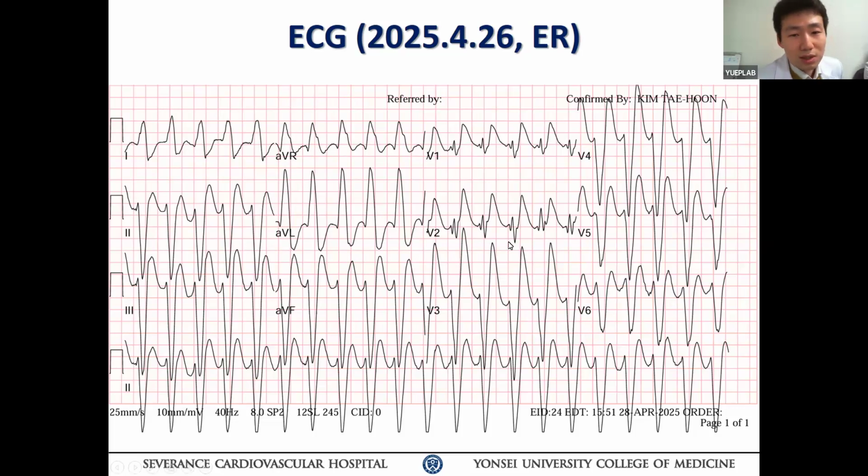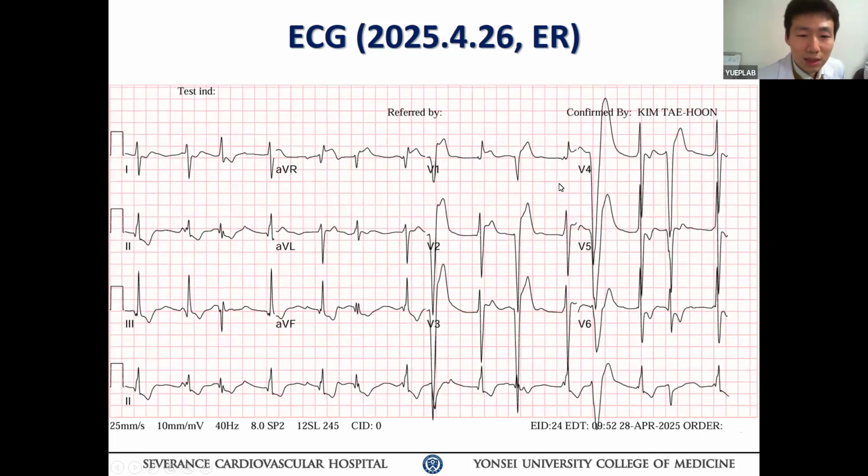The patient in the ER, the rhythm self-terminated and changed to this rhythm. And I think this rhythm is also interesting. Okay, this time let's start from here.